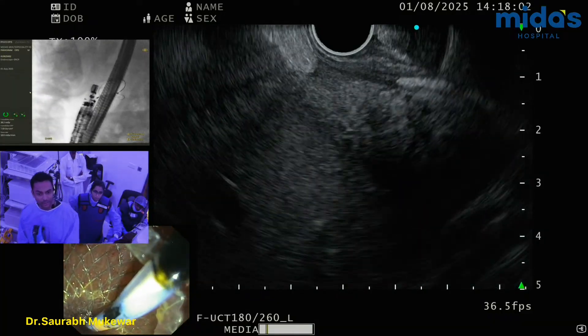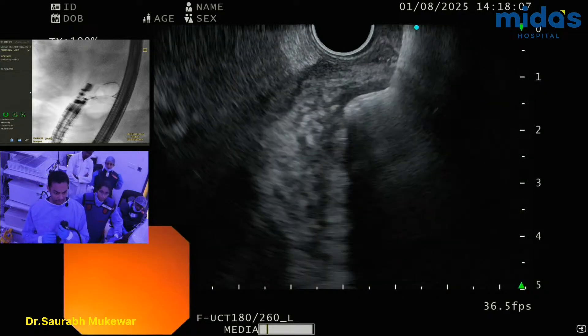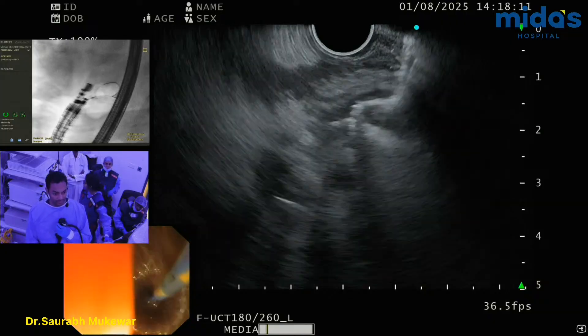So, 7 French? No — take the 10. Yeah, 10 French is going to be made just of that stuff, and if it gets stuck then you're in another problem, because a newly placed stent — you don't want to have any problems with that. So you see, on the US view that's the stent and the material is very thick inside. Against my initial plan, I'm going to go ahead and put the wire. Wire please — 7 French double pigtail.